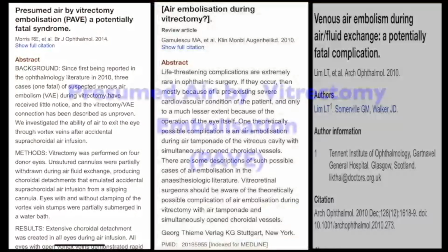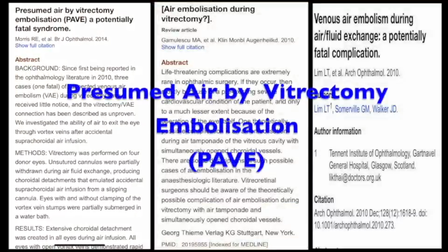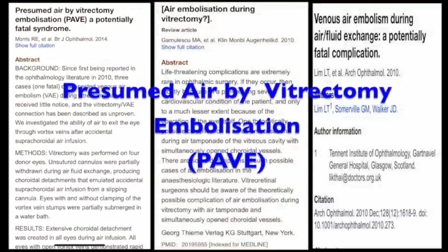Already a few deaths due to venous air embolism during VR surgeries have been reported in the literature. The risk is going higher presently in this era of MIVS, as infusion cannulas are no longer sutured to the sclera. Perhaps the Almighty helped me to save not only the eye but the life of the patient that day through a very prompt and effective measure. Thank you.